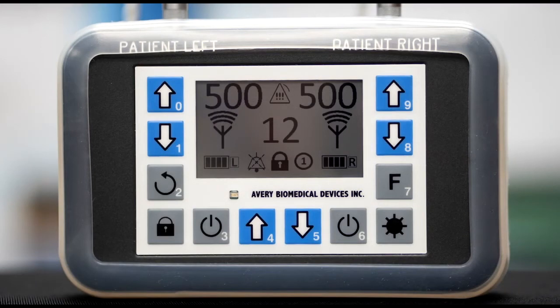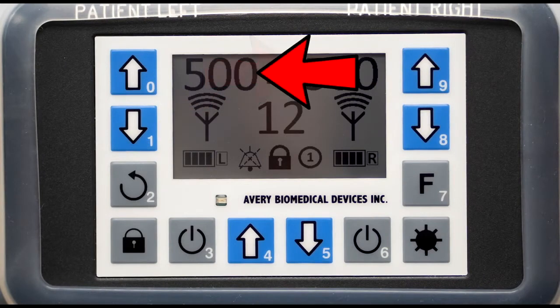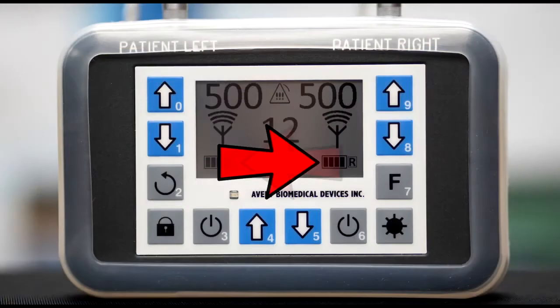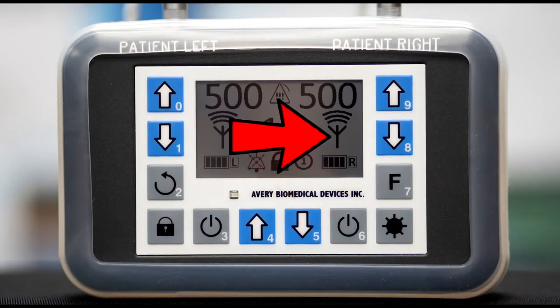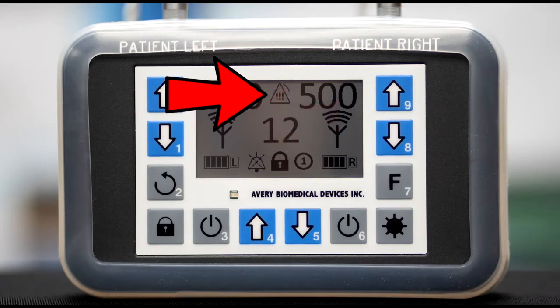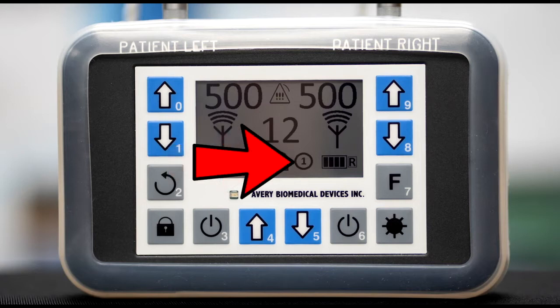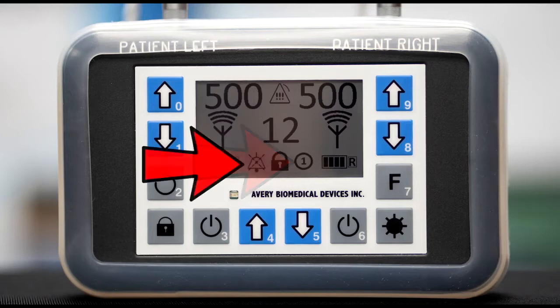The graphics display shows all the relevant stimulation parameters as follows: respiratory rate, right and left amplitudes, right and left battery charge status, right and left antenna connection icon, right and left RF signal indicating that the antenna is transmitting signal, alarm icon, keypad lock icon indicating that the keypad is locked, parameter mode icon — mode 1 is factory standard — and the mute icon showing that the alarm is temporarily muted.